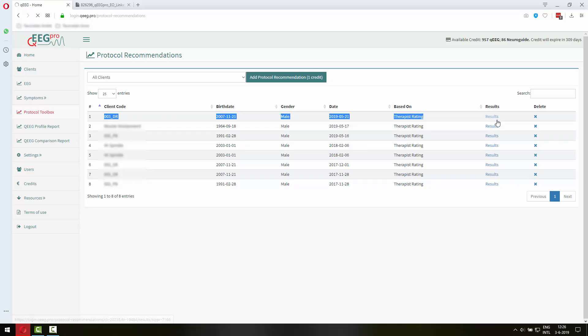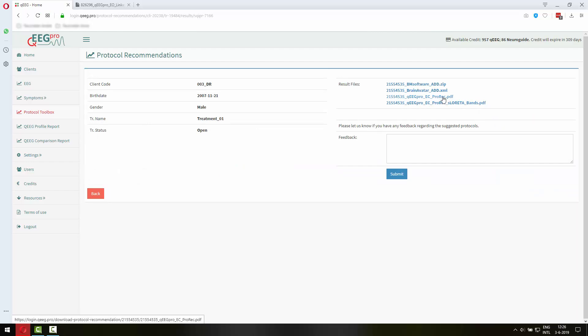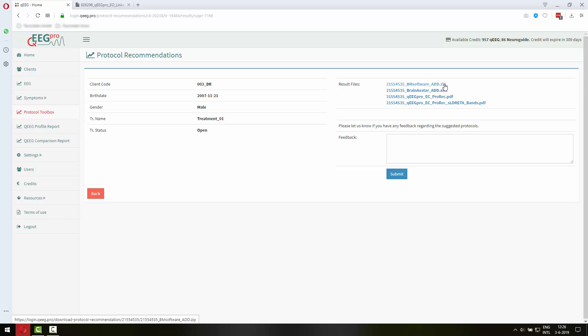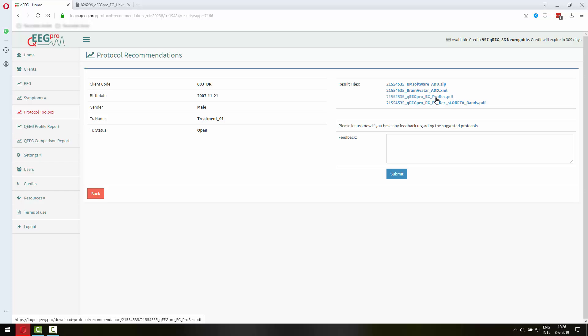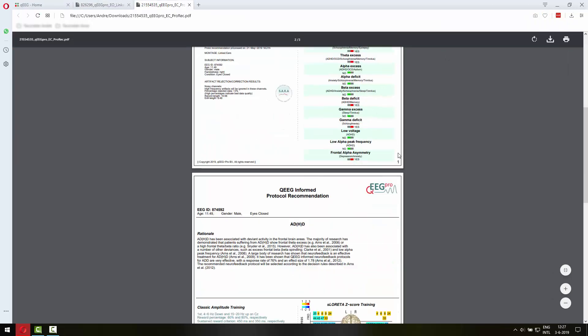So let's look at the results and as you can see not only are there PDF files here but also an XML file and a .zip file. So I will get back to these later.